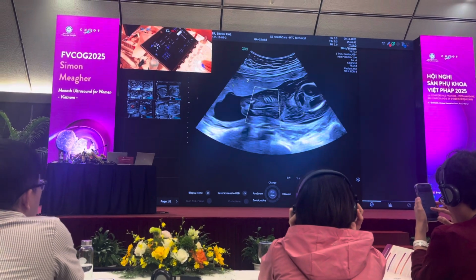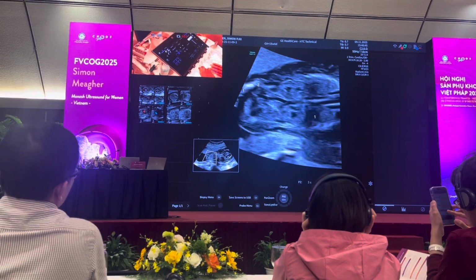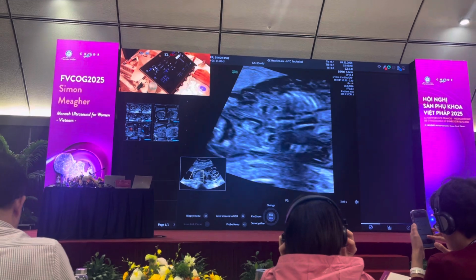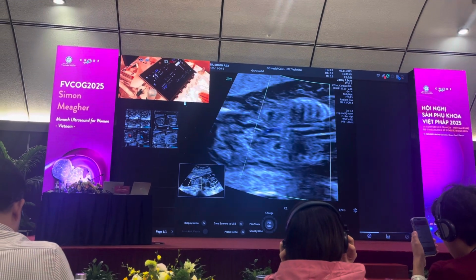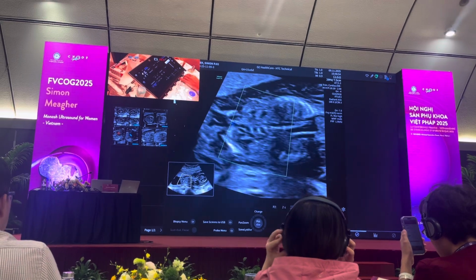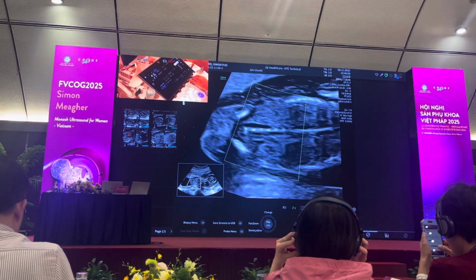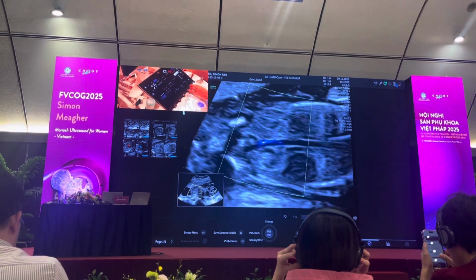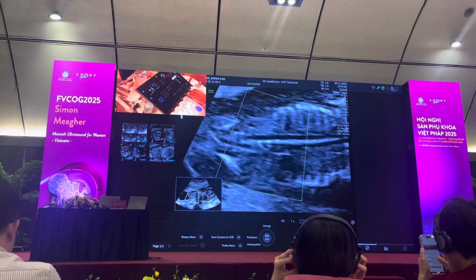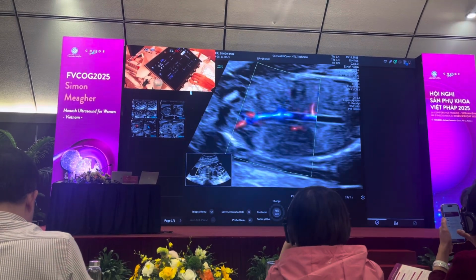When you look at the kidneys and you see a duplex system, you want to check the renal arteries. When you're looking at the renal arteries, you put on power Doppler. Sometimes with a duplex kidney, you may find that there are 2 renal arteries. Bring that down, reduce your PRF to get the renal arteries coming off to supply the kidney. Bring that down to 7 centimeters a second, and then increase your power output.